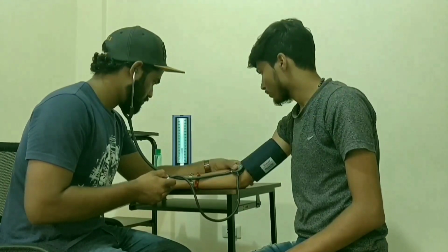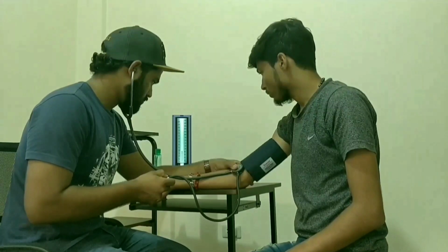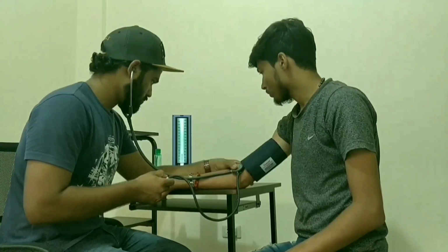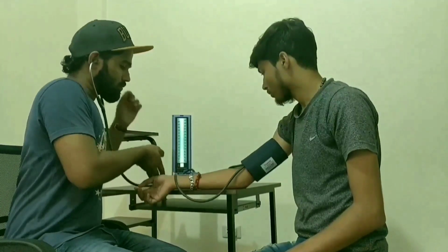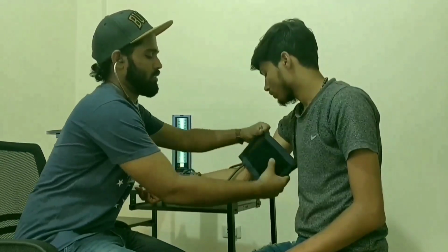And when the sound disappears, you will slowly deflate the cuff by another 10 millimeters of mercury, and after that you will rapidly deflate the cuff. And remove the cuff from the patient's arm and make the patient comfortable.